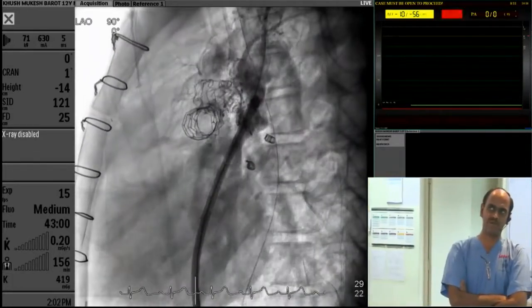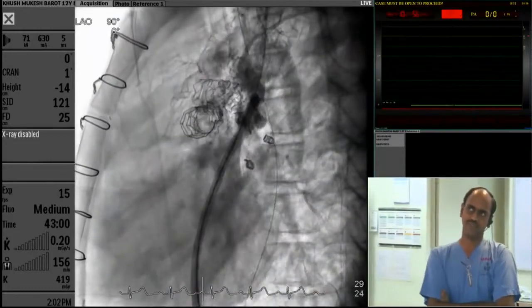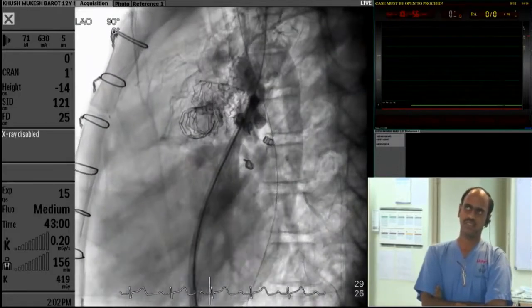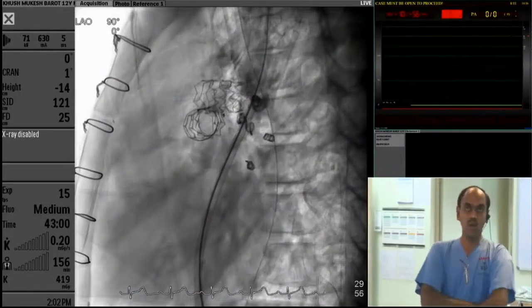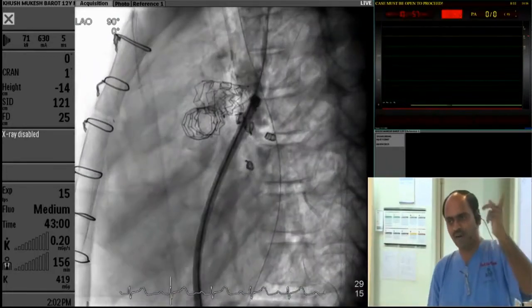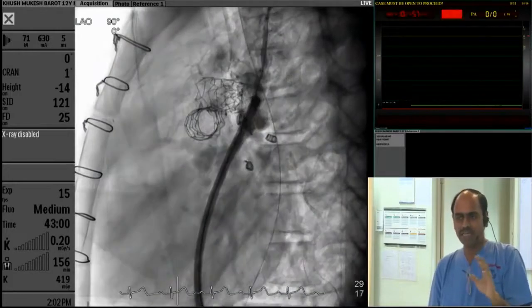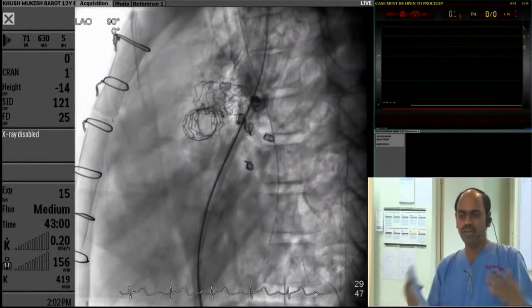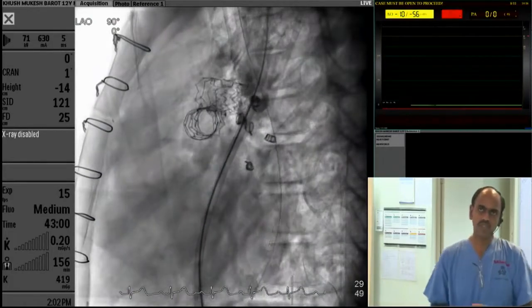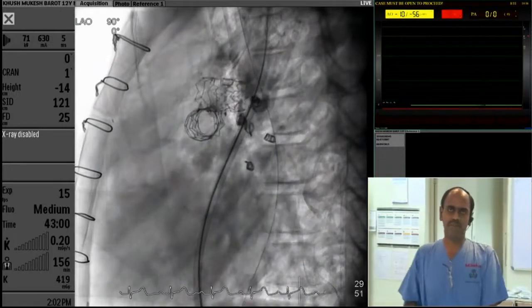I have a stent in the right pulmonary artery and a stent in the left pulmonary artery. There was a lot of flow — the superior vena cava was decompressing into the azygous before, but it was not good enough to decompress the pressure in the superior vena cava. There was a very prominent azygous noted during the previous diagnostic angiogram. I think we can see the filling of the pulmonary artery.